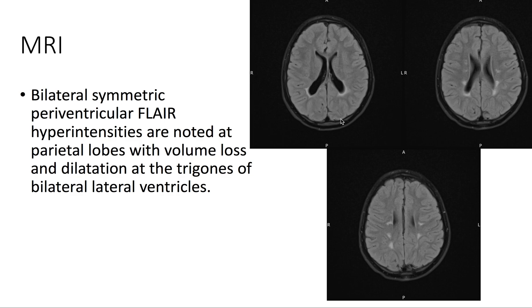...we see hyperintensities noted about the parietal lobes with volume loss and dilatation at the trigones of the bilateral lateral ventricles.